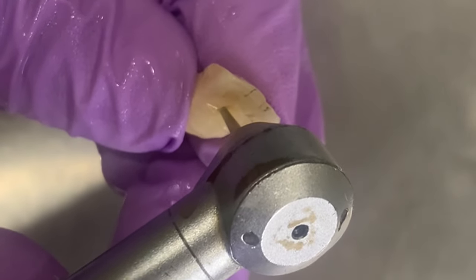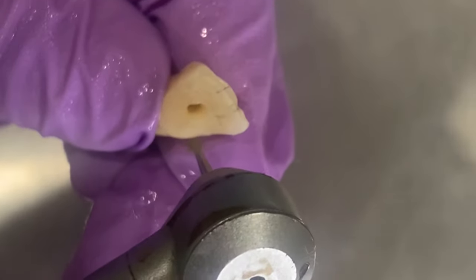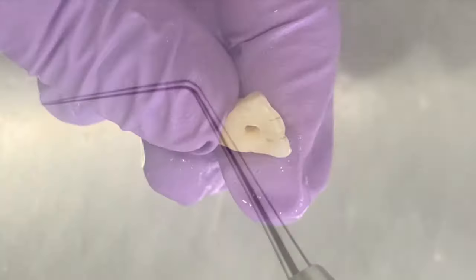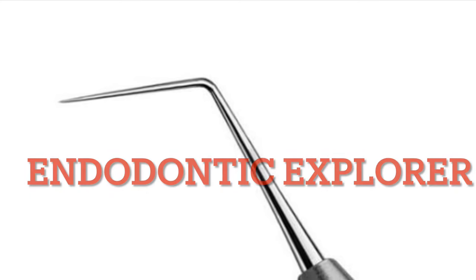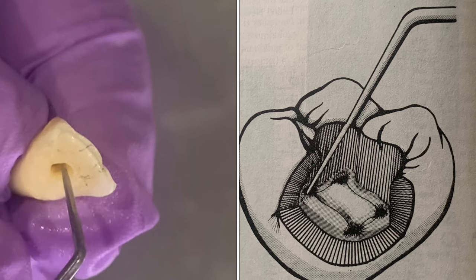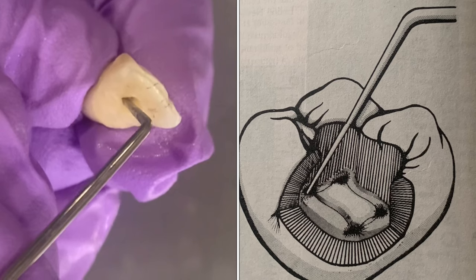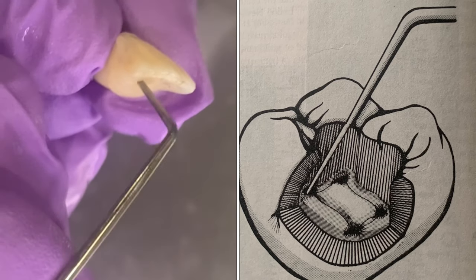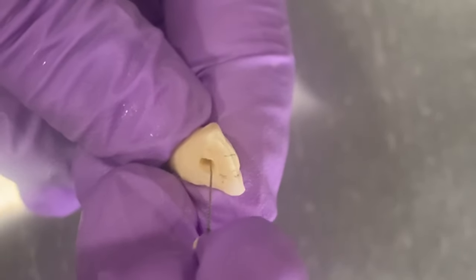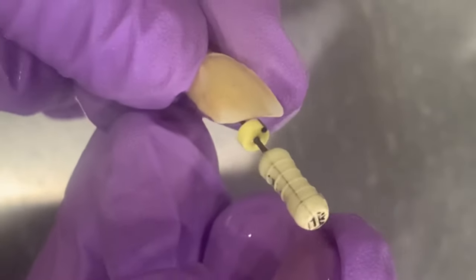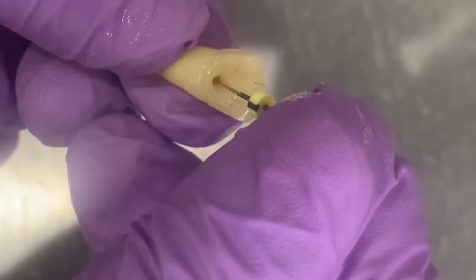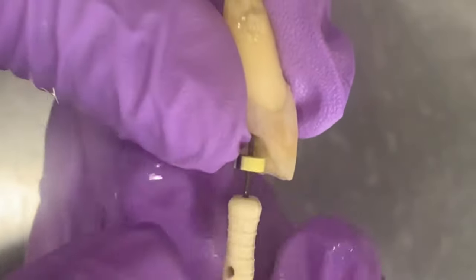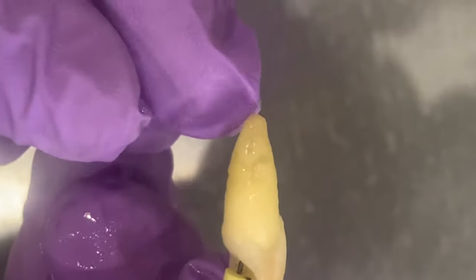An endodontic explorer is used to locate the canal orifice. Once the orifice is located, then we can use a file. I have used a 15 number file to enter through the orifice into the root canal. See, it has easily entered. Normally the root canal of central incisor is large, simple in outline, conical in shape, and it is centrally located. You can see the file has come out through the apical foramen.